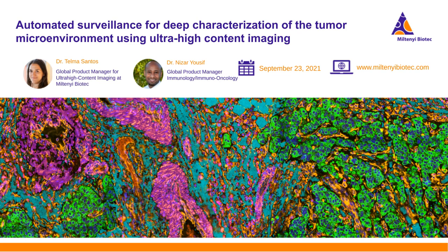I'll go for this question. The MACSima imaging technology is based on wide field fluorescence microscopy. So for the best results, of course, thin sections are preferable, from 3 up to 10 micrometer. And in our experiments, we averagely use 5 micrometer sections.